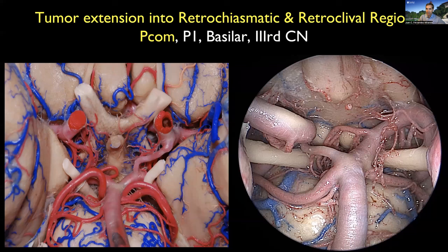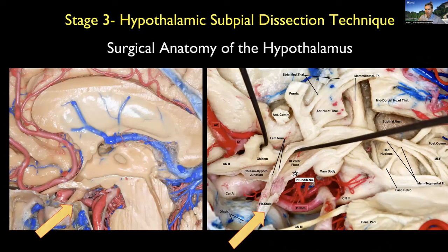Once we pass that first layer of the superior hypophysial arteries, we go more posteriorly into the retrochiasmatic space, which is full of very relevant anatomy. This is the first area where the superior hypophysial arteries and stalk are located. Going retrochiasmatic, we have all the secondary branches from the carotid artery and, of course, the PCOM — posterior communicating artery — which forms the lateral aspect of the exposure. We need to be very careful with the relationship of the tumor capsule with the PCOM, and dissect it off the capsule, following all the way to the posterior cerebral arteries and the basilar bifurcation.